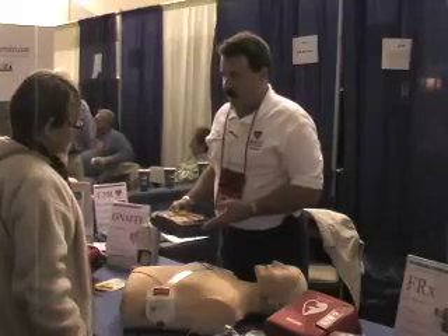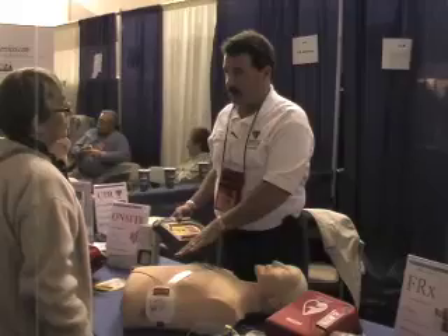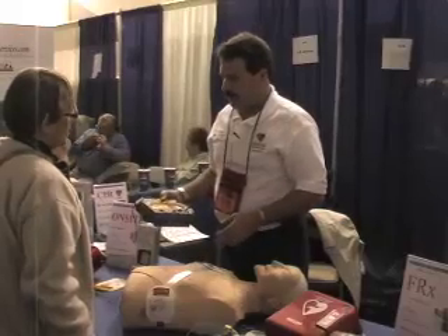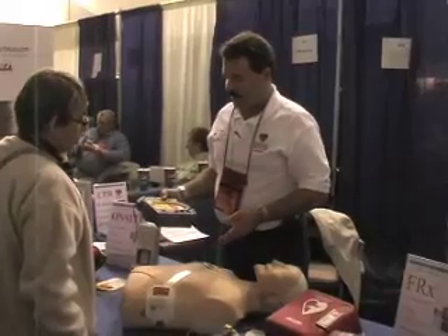And then it's telling you not to touch the patient. The reason for that is it'll pick up your heartbeat if you're touching the patient. So it's going through an analysis right now to find out if it's a shockable heart rhythm.